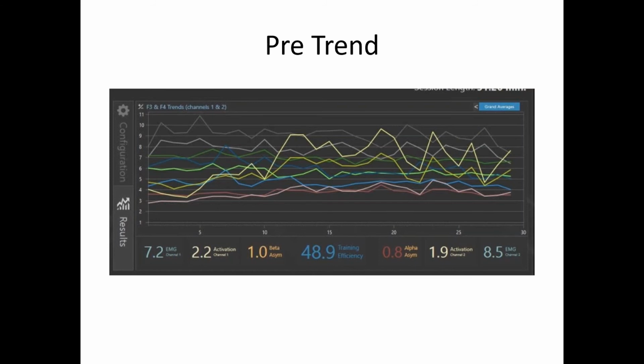The reason is because there is no neuroscience to underwrite the others. There's a lot of people claiming there is. That gets us into a lot of speculation. I'm dealing with people's lives and so forth. I want the best statistical information I can get, and then I'll make a decision. And then I'll throw in what I know anatomically. Then I'll throw in what I know from experience. Then I'll throw in what I know from intuition. I think those are important, but I've got to start with where are the worst locations and what's the best harmonic solution? What's the best protocol?